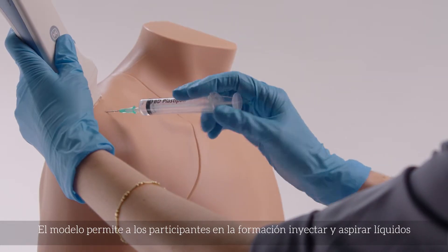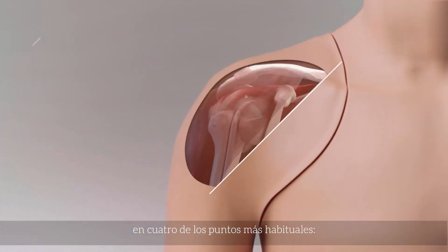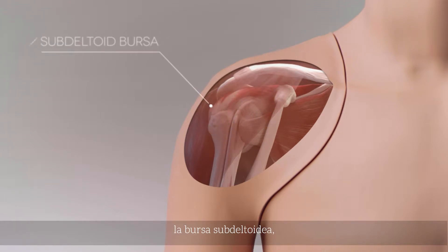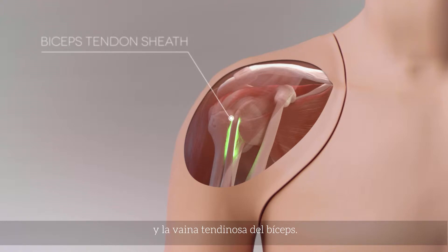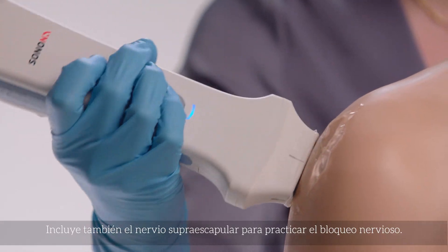The model allows trainees to inject and aspirate fluids in four of the most common sites: the glenohumeral joint, subdeltoid bursa, acromioclavicular joint, and the biceps tendon sheath. It also features the suprascapular nerve to practice nerve block.